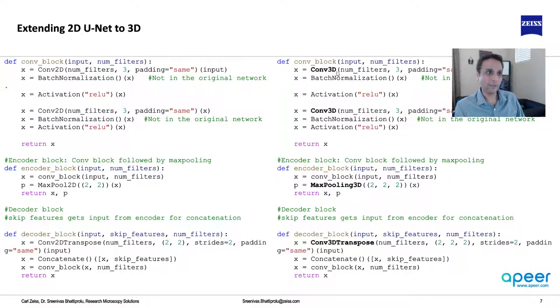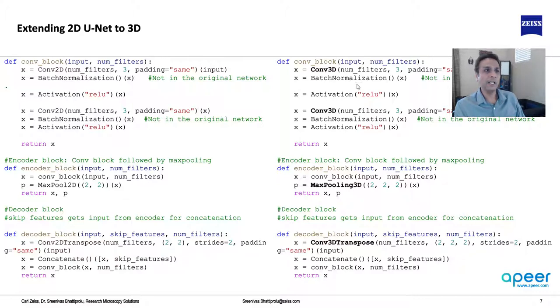Keras layers has Conv3D just like Conv2D — we import it and change the kernel from 3 to 3×3×3, which is what Conv3D implies. Similarly, MaxPooling changes from 2×2 to 2×2×2, and Conv3DTranspose also uses 2×2×2 with stride 2. That's pretty much it. Once you understand what's happening here, it's just a matter of getting the data ready for the U-Net.